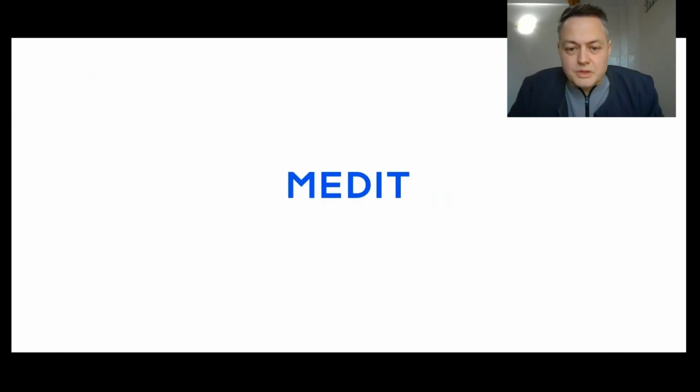So I hope these techniques will prove useful to you, and I hope that they will add value to your way of diagnostics and of doing wax-ups. And we'll see each other in the next webinar, where I'm going to show you how this wax-up and these techniques can be applied during the scanning phase. And also in a future webinar, we'll see how to do the temps and how to do definitive crowns from these files we've just gathered, and maybe how to do splint for injection techniques, how to do models in model design for these wax-ups. So everything is going to come together in the future steps.